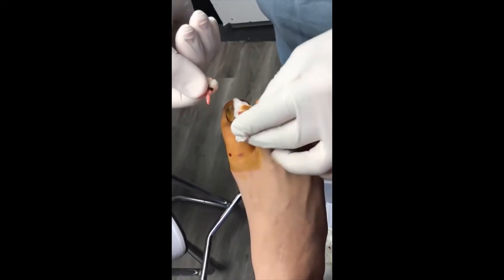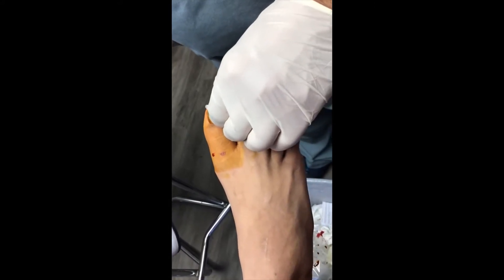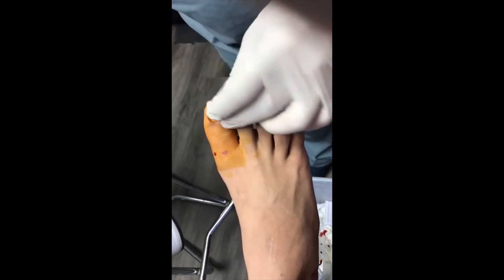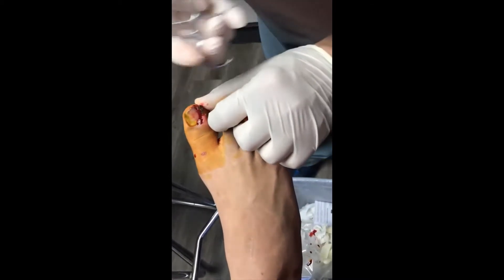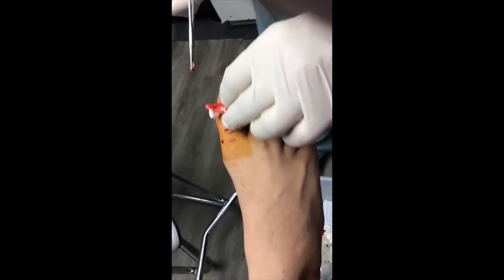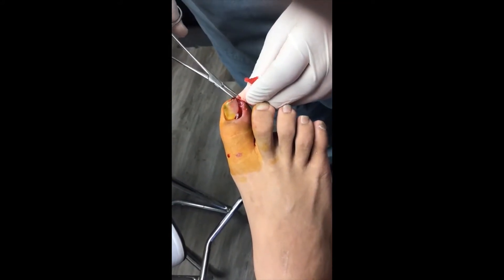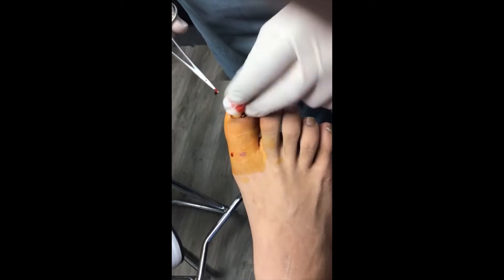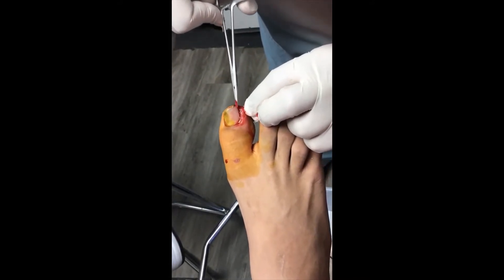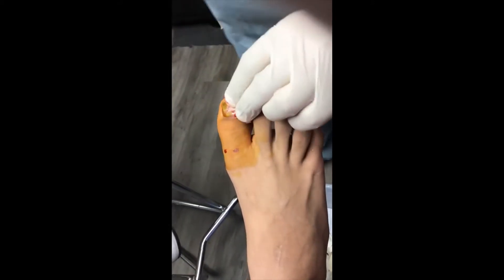Let's see how far back we're going. You can see the nail came out, and you can see how wide it was. We're going to see if there's any other pieces left. Looks better already, right? We've still got some in there.